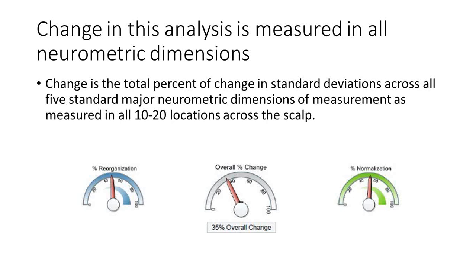And that was something that was not looked at very much until we put together the new mind map system, not in this way. But as clinicians, this is what we wanted to know. How much does the brain change between training sessions? How is it affected by distress in the family? How is it affected by the health status that they bring with them to the training situation? What factors impede or aid neurofeedback training? How much does the brain actually change when you train it? What's a good rate of change? What's a bad rate of change? Or insufficient rate of change? All big questions that we're not getting answered. There's no research or grants for it. So we tried to standardize the system and have standard measures in order to begin to at least get a glimmer of what's going on.